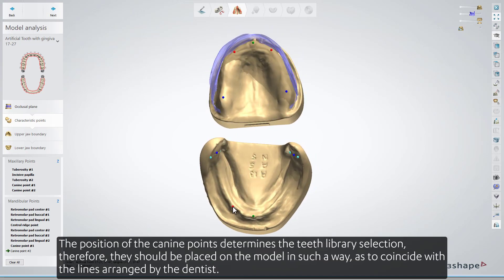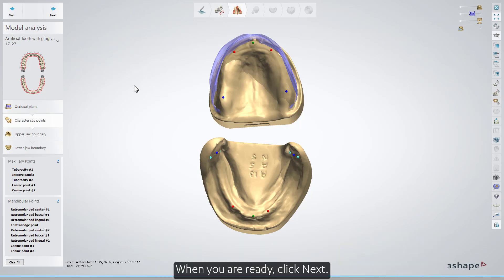The position of the canine points determines the teeth library selection. Therefore, they should be placed on the model in such a way as to coincide with the lines arranged by the dentist. When you're ready, click Next.